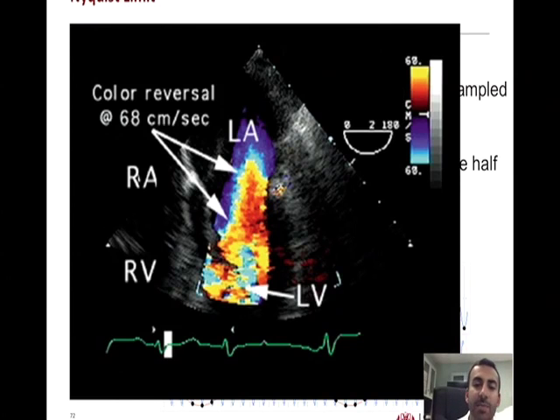Very important concept, because the Nyquist limit is how we identify appropriate ranges and how we quantify flow patterns. So in other words, there's a certain Nyquist limit when it comes to cardiac exams for cardiac valves, for example. There's a certain Nyquist limit range that we look at for venous structures, and that scale, again, which is the Nyquist limit, has set parameters that we want to make sure are there when we're doing those particular examinations. And we'll talk about that in further detail when we go to those specific modalities.